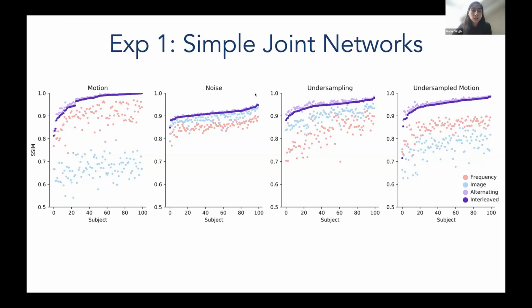For MRI in particular, the inference times here are about on the scale of a couple hundred milliseconds. So we probably would need to get that down to be a little bit faster if we wanted to adjust the scan in real time. But if you just are doing a scan and then want to look at the reconstruction, it should be more or less instantaneous from the point of view of the user.